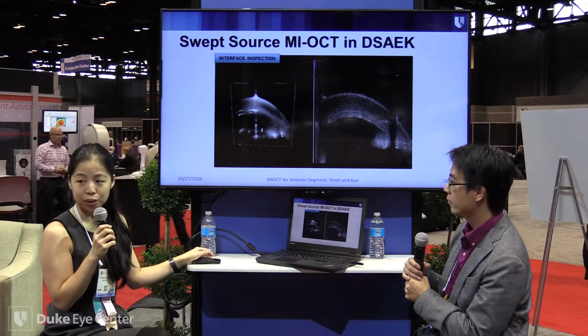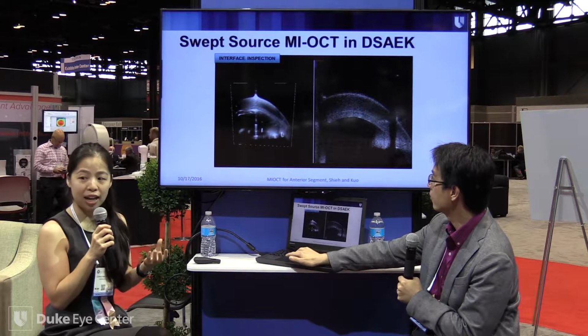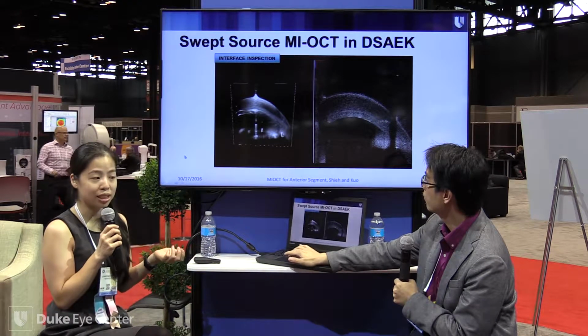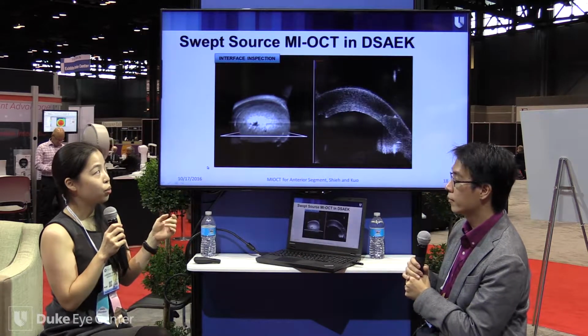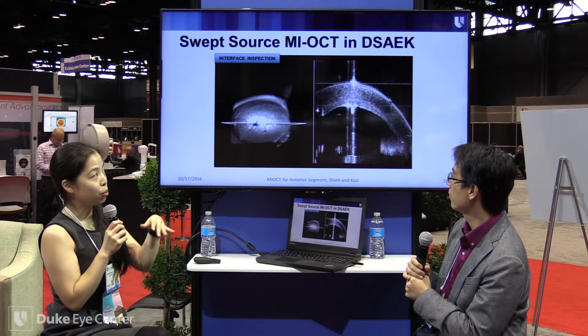Furthermore, interface fluid in DSAEK is the enemy of the surgeon. We want to try to have that new graft lenticule perfectly opposed to the donor host, such that there's less chance that the graft will detach and that we'll have issues of rebubbling. And so here's an example actually in the operating theater where the surgeon had not been aware of fluid, but we were able to release it.